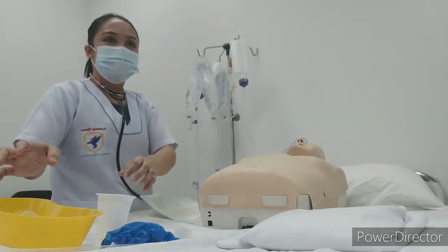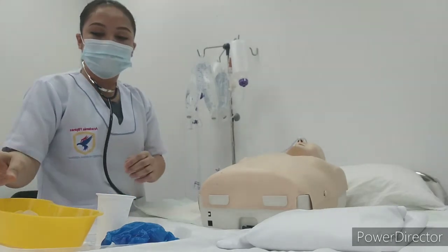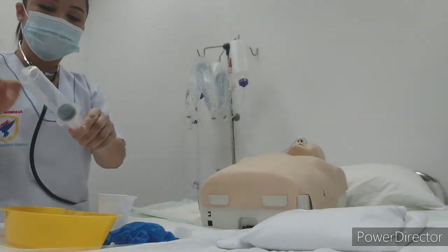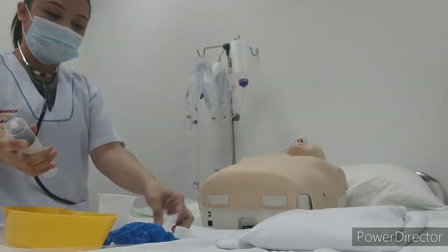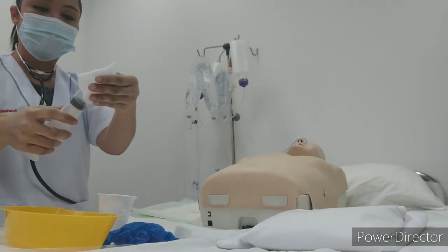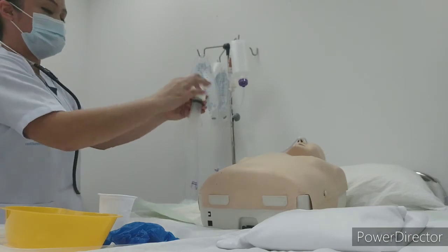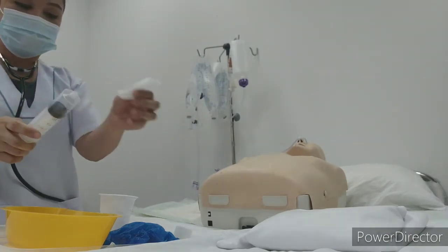If I am going to use this again, for example this aseptic syringe, I need to cover this one with a gauze, like this, in triangular shape, and then with the plaster.